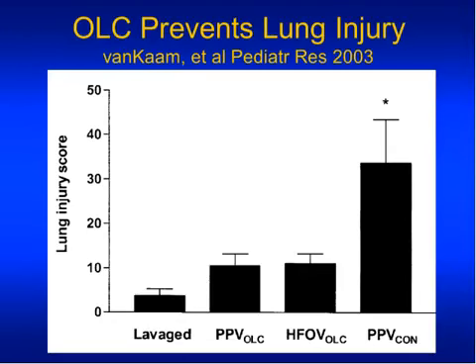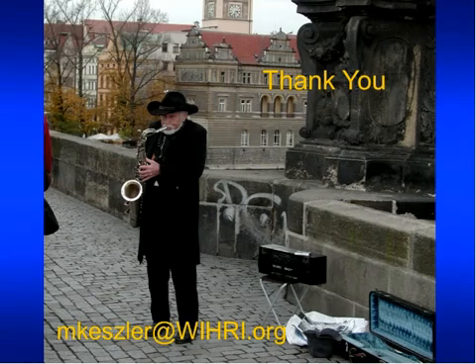Thank you, Dr. Kessler. That was great. As you were speaking about the babies and volume-targeted ventilation, I was transported a little bit back in time to standing at the baby's bedside next to the old Sechrist ventilators delivering surfactants, and then standing at the Sechrist ventilator for quite some time, monitoring pressures and adjusting as the baby's compliance changed. In the context of volume guarantee, volume-targeted ventilation, when we deliver artificial surfactant, is that something that we'll need to hang out at the bedside and adjust?